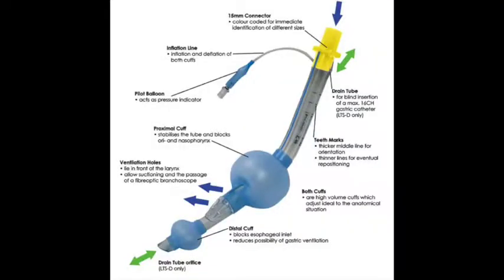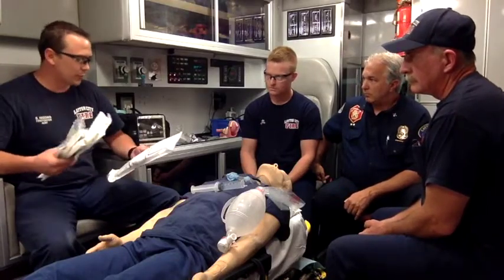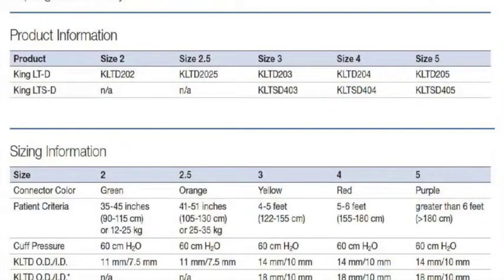Yeah, we totally can. In fact, I will tell you, of all the problems that we came into, the thing that people just kind of, for lack of a better term, used to swag on was sizing and inflation. So let's talk about those. Pretty much all that info is going to be found on the packaging. You size it by the height of the person, which they have here in feet or centimeters, and then on the smaller ones for the kids, they have it in inches or in centimeters as well.